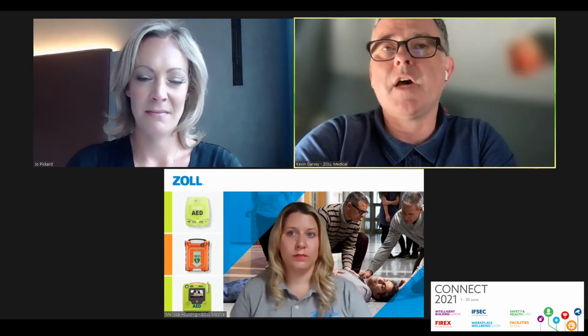But the voice prompts are user-paced, so the quicker that you work and follow the instructions of the device, the machine will work at your pace. But they are designed to be used by laypersons with no previous knowledge or clinical knowledge or experience. So whilst training is advisory, it's not a requirement.